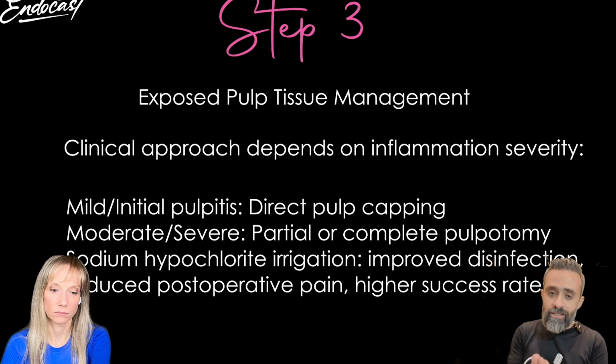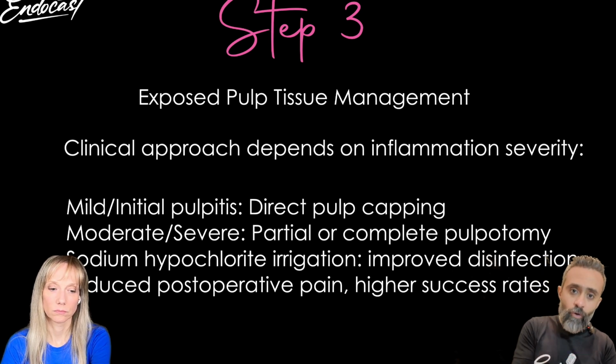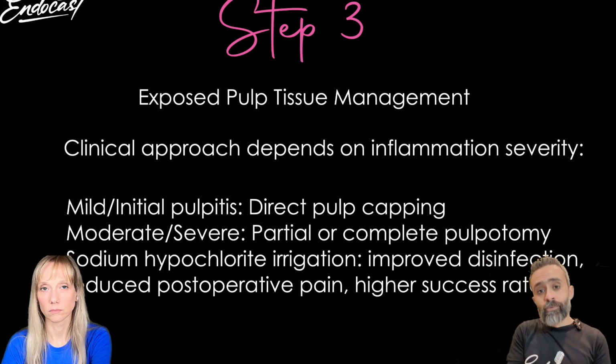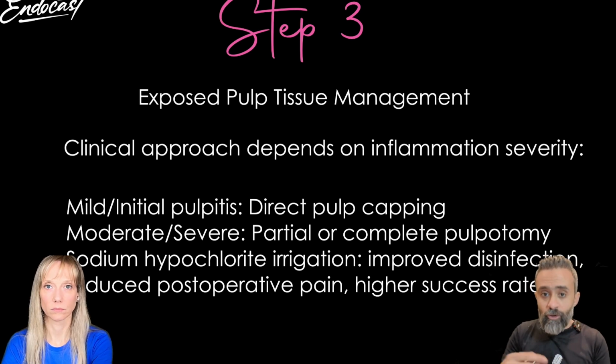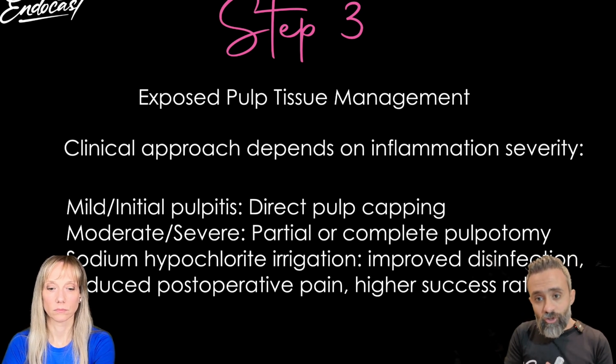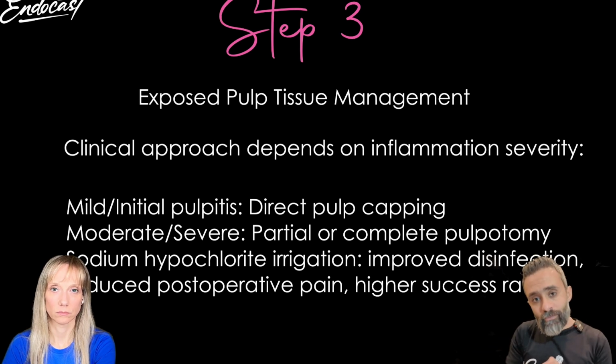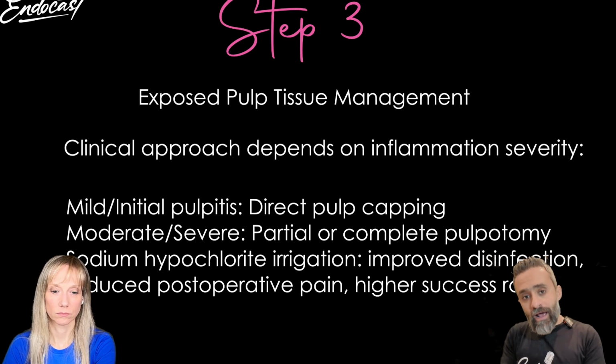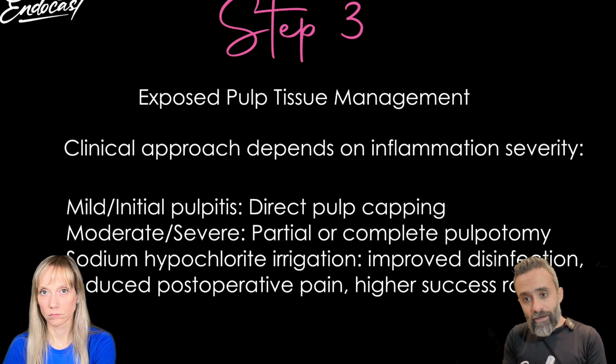So in those cases, I will move forward to a more invasive procedure, which is enlarging the exposure in order to visualize the tissues better and maybe to remove part of that tissue from the exposure to do a partial pulpotomy rather than doing a direct pulp capping.